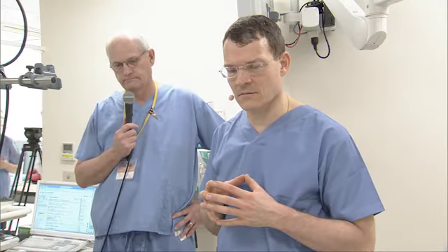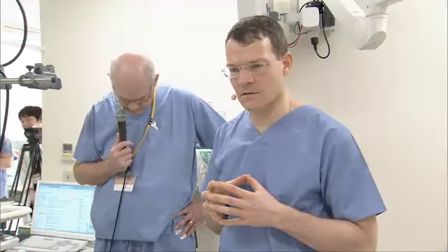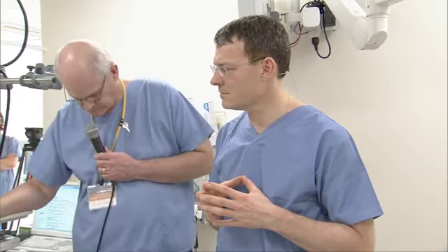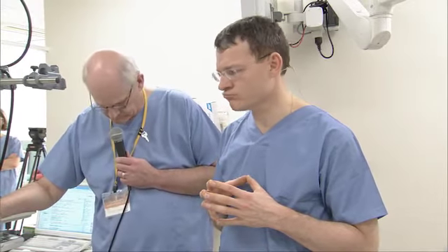Okay. Dr. Haas and Dr. Seewald, would there be any role for potentially pre-surgical or intraoperative pancreatoscopy to help delineate resection margins? Yes, I think this is a very interesting point. We have heard a lot about SpyGlass technology. I had now the first case where my pancreatic surgeon called me in the OR.